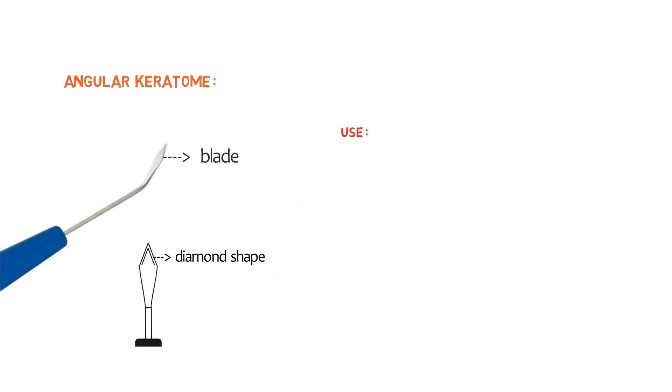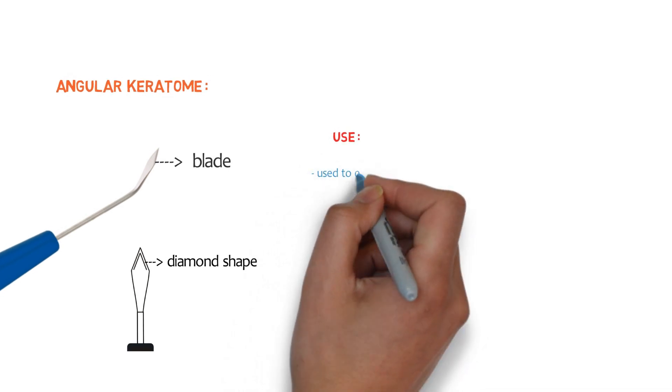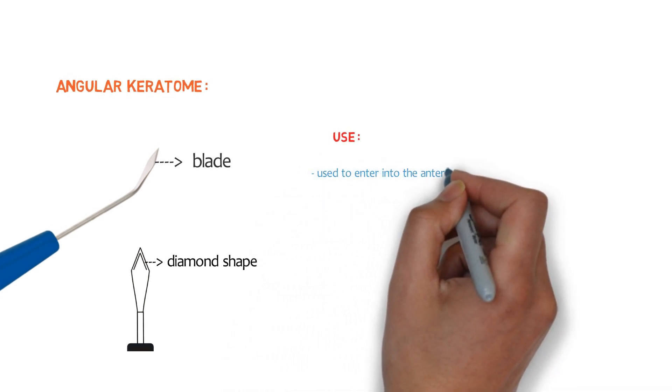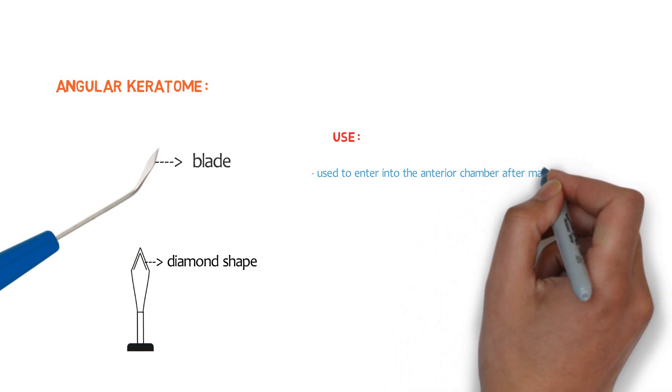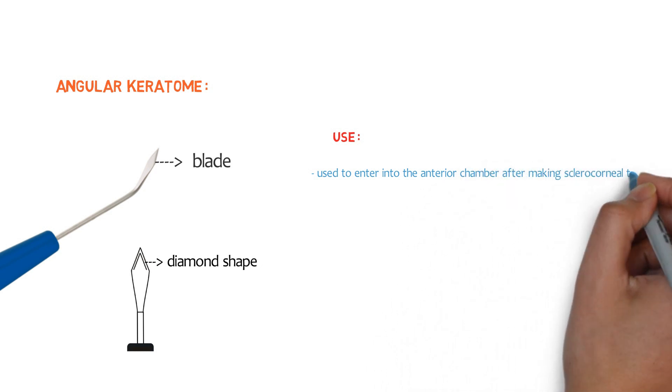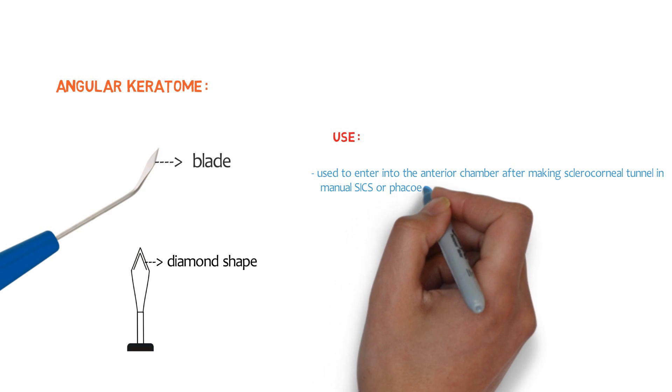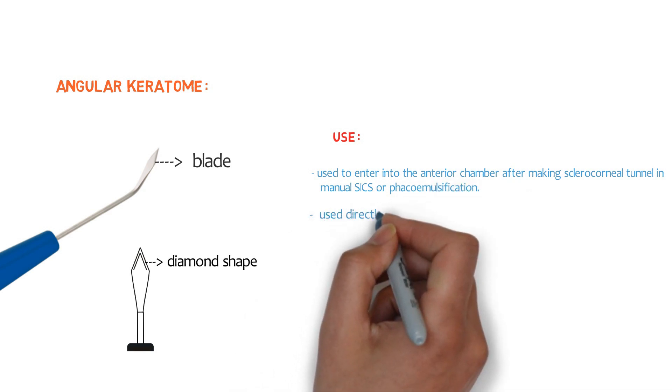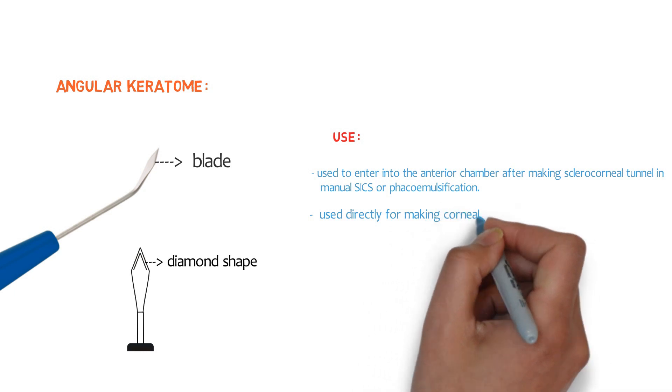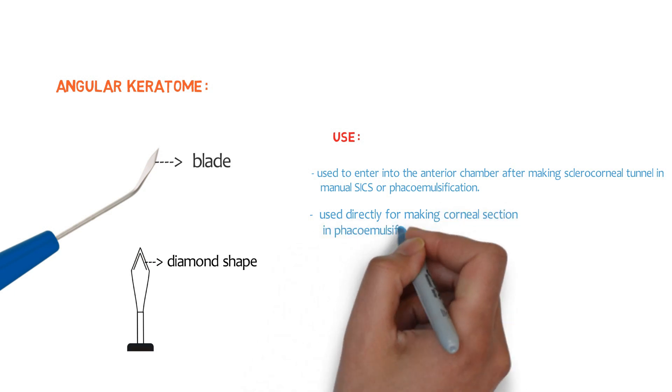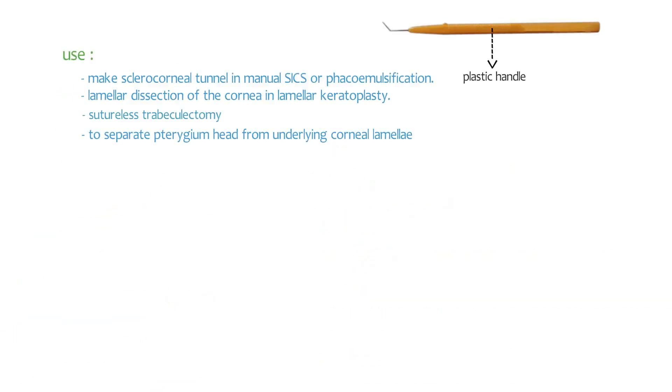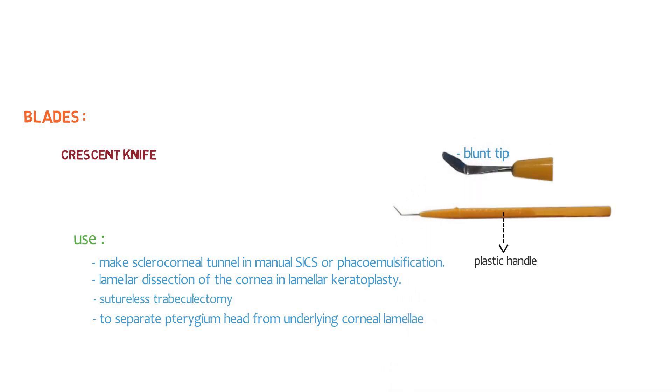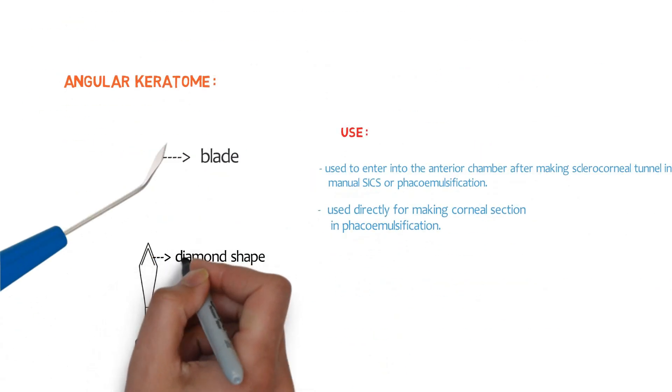Let's talk about its uses. The first one is it is used to enter into anterior chamber after making sclerocorneal tunnel in manual small incision cataract surgery or in phacoemulsification. The another one is it is used directly for making corneal section in phacoemulsification. So these are the uses. Don't get confused between keratome and crescent knife. In crescent knife having blunt tip. And here we have the sharp edges.